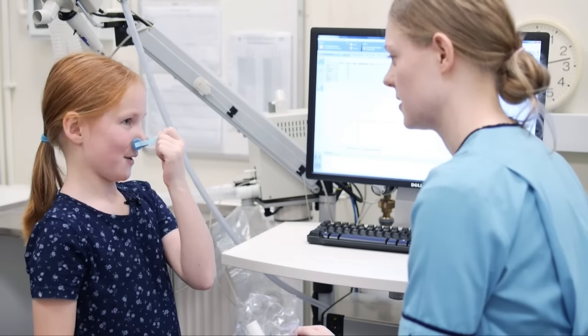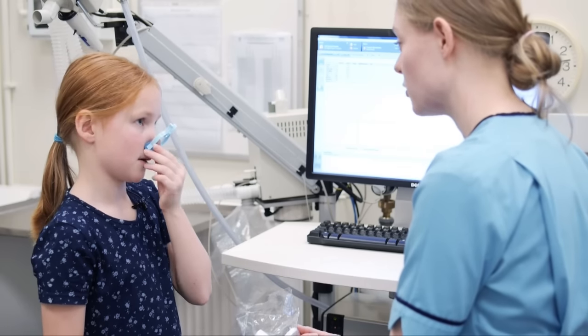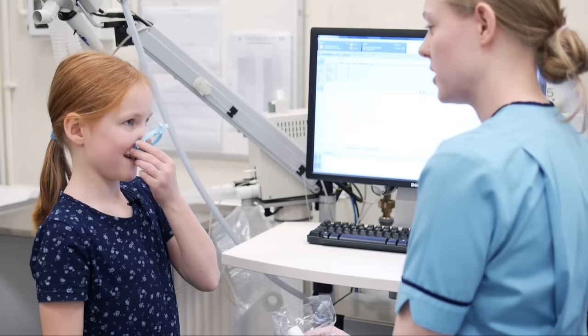So the first test that we're going to do, what I'll get you to do is nice normal breathing like you're doing just now, but you'll do it into my machine. And then I'll get you to do a really big breath in, fill up your lungs all the way to the top, and then you're going to blow it out really, really fast for as long as you can, and then a nice big breath in again at the end. So I'm going to show you what I want you to do. So it's like this. Shall we give it a go?